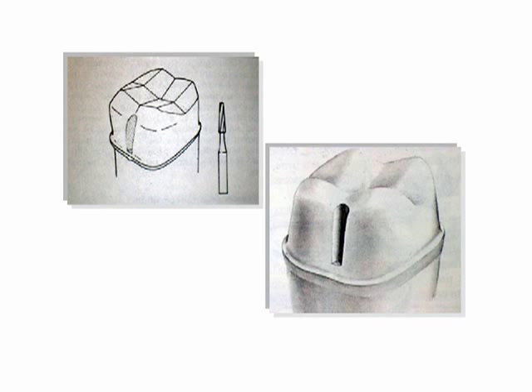Step 6. Place a groove to increase resistance form. Used when resistance form has been compromised. Placed with slow-speed tapered carbide burr, number 170. Avoid placing groove on the finish line.